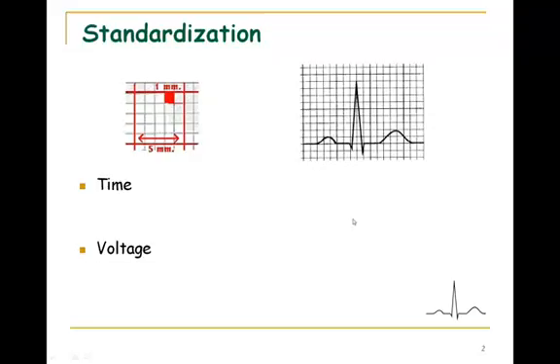So for example, why would I want to use this? Well, if you look at the QRS complex right here, how long did the ventricles take to depolarize? The QRS complex represents depolarization of the ventricles. It begins right here and it ends right here, and this corresponds to 2 boxes, which would be 0.04 times 2, which is 0.08 seconds.